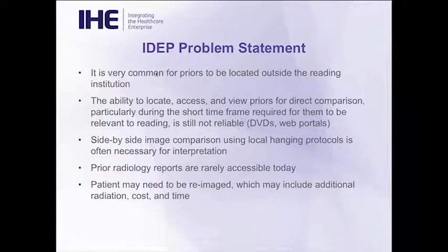So the problem statement for IDEP. As we said, it's very common for prior radiology reports as well as studies to be located at other institutions. The ability to locate and access and view these directly is a very short time frame when that is functional and is of use to the radiologist. So going to a DVD and trying to import a DVD or look at a different monitor or look on a web portal isn't the correct way to do things.